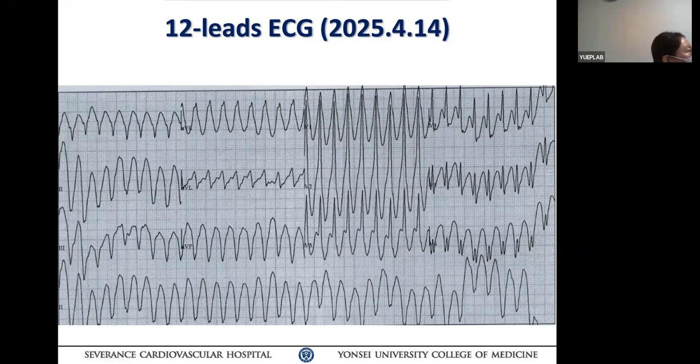So you may argue, oh, there may be atrial arrhythmia going on. That's very reasonable. Then if you go further into that, you say, oh, could it be atrial flutter? Could it be atrial fibrillation going on simultaneously with this VT, which can influence your QRS duration, also amplitude, because if you have intermittent capture beat, yeah, let's take a look at lead one. We have to explain why some of them are wide, some of them narrow, QRS complex, right? In the VT.